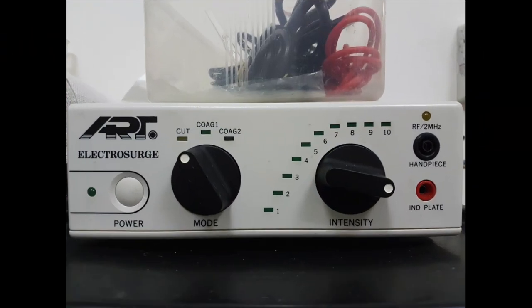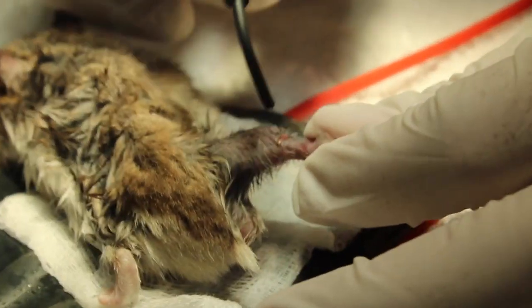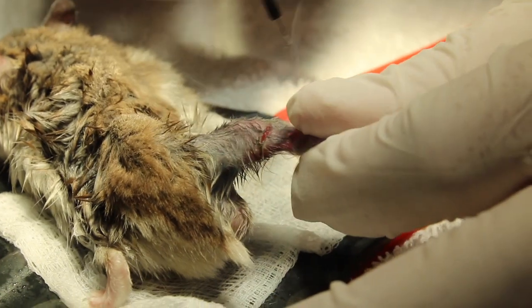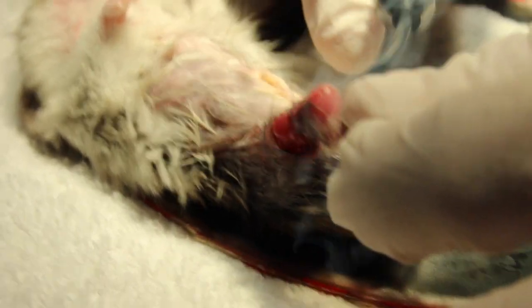Now the amputation begins. This amputation is done by electrosurgery. This electrosurgery machine provides high frequency alternating electrical current to allow the surgeon to cut through bone and muscle. The surgeon is amputating the hamster at its knee joint.